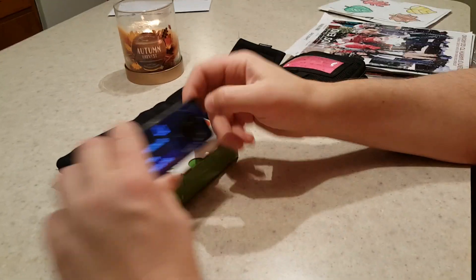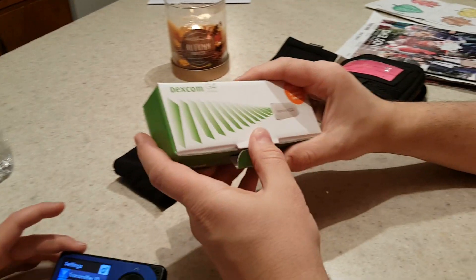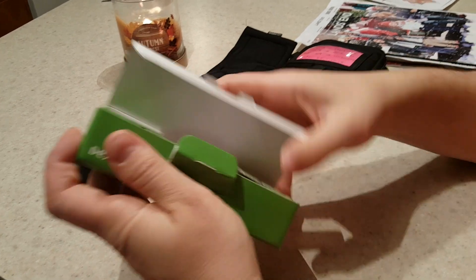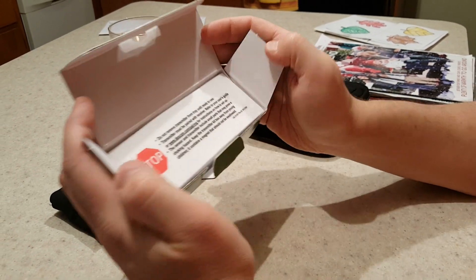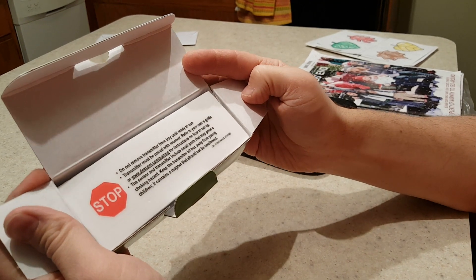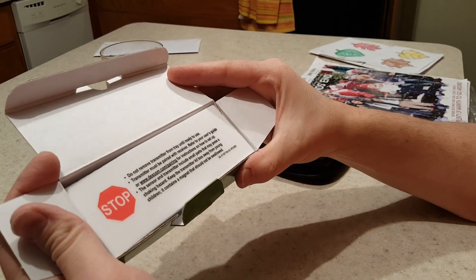So what we're gonna do — it's on your leg, right? We are going to open this up. It's important that you don't take it out until you're actually ready to use it. It says right on it: 'Do not remove until ready to use.'